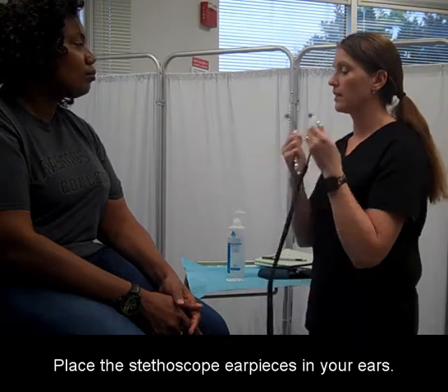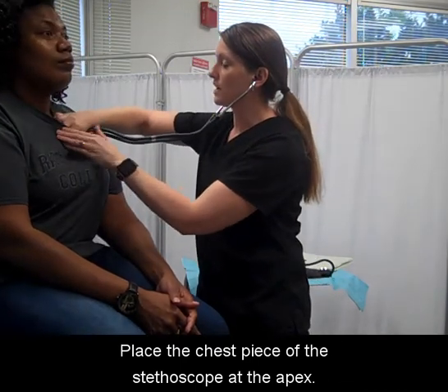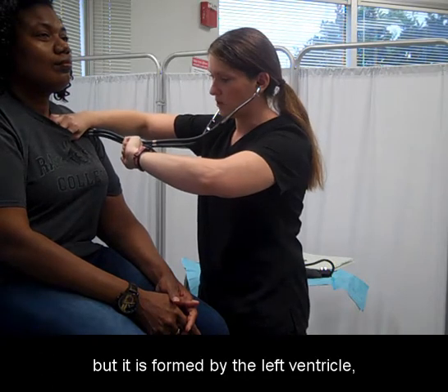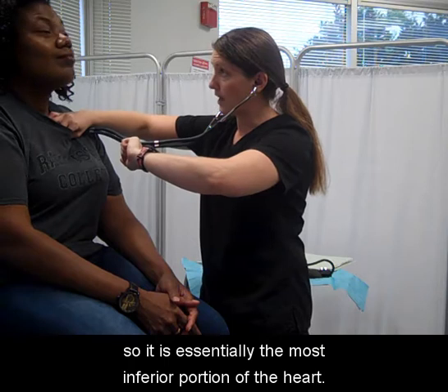Place the stethoscope earpieces in your ears. Place the chest piece of the stethoscope at the apex. The apex of the heart is the tip, but it is formed by the left ventricle, so it is essentially the most inferior portion of the heart.